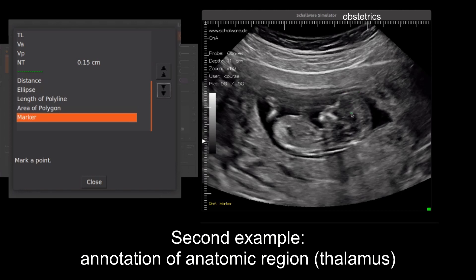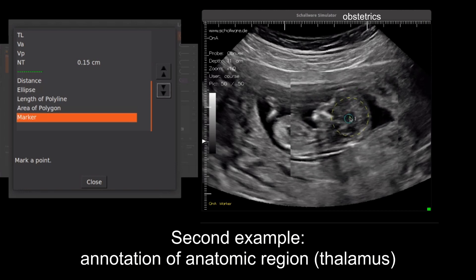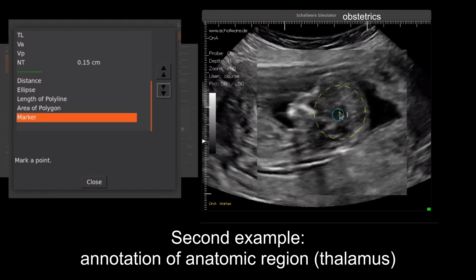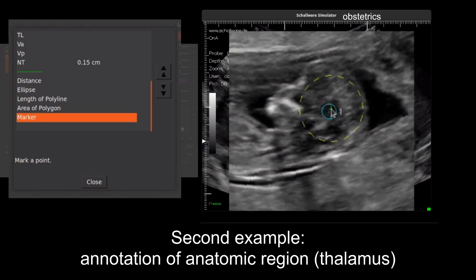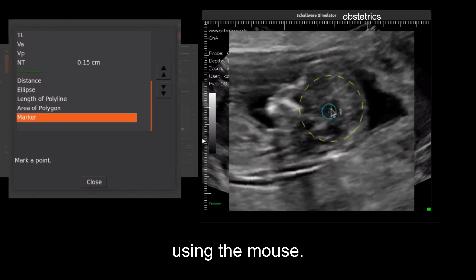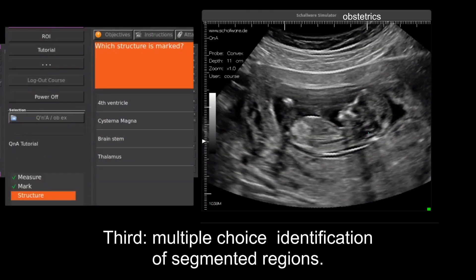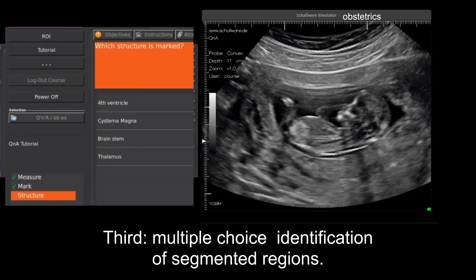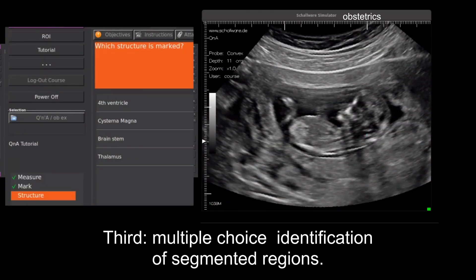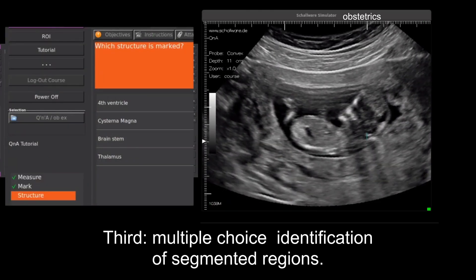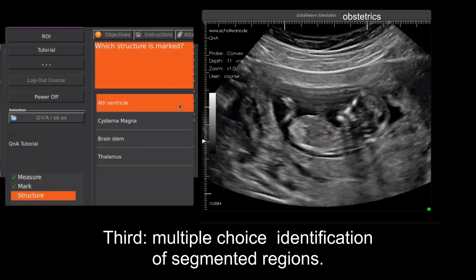Second feedback method: annotation of anatomic region — thalamus — using the mouse. Third assignment: multiple choice identification of segmented regions.